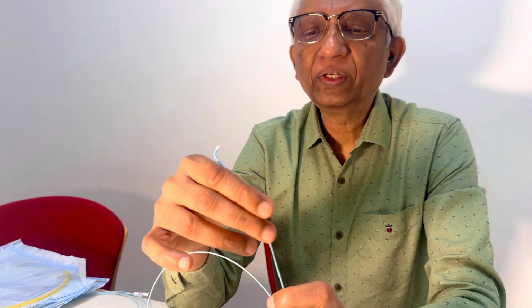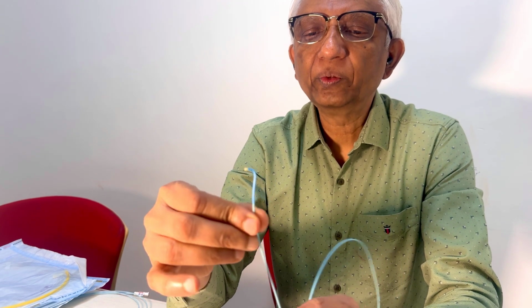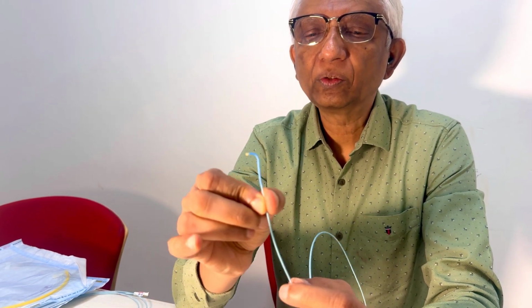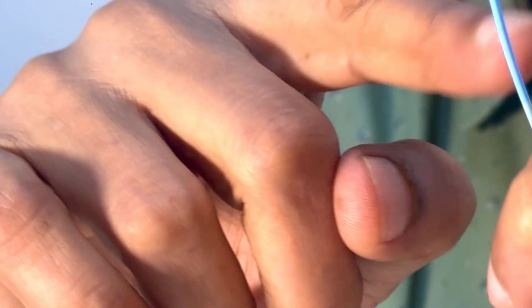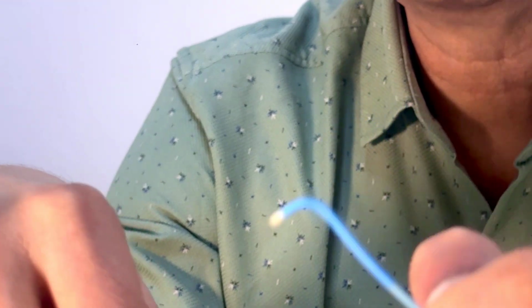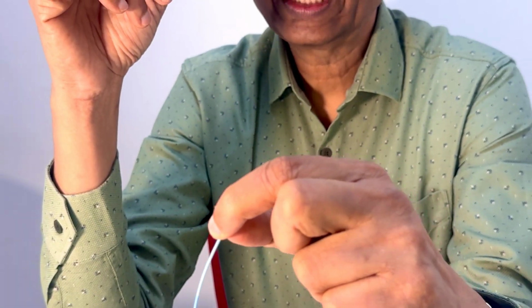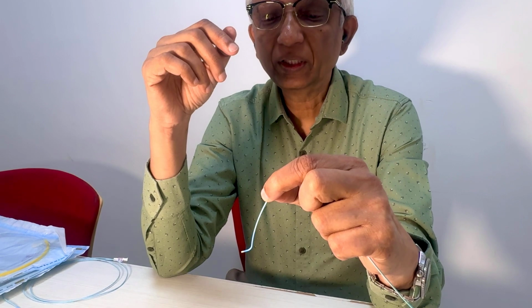Now, where can you use the Bernstein? One, very often in a not so complicated aortic bifurcation, you can use it to cross into the opposite iliac, or the bifurcation, just by placing it this way. Okay, and then you take the wire out and it goes down. You can use it then to come down, enter the profunda or the common femoral artery, right? You can enter into the tibial vessels, into the ATA, the PTA, the peroneal trunk.